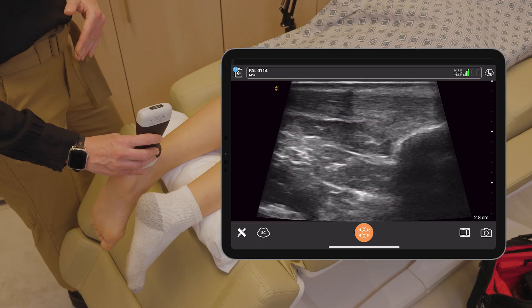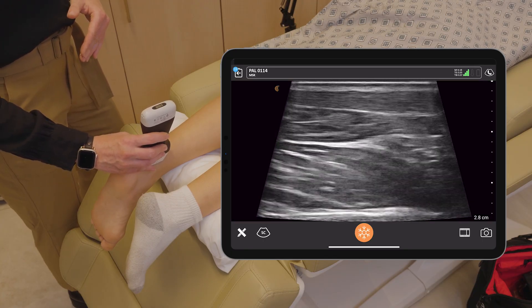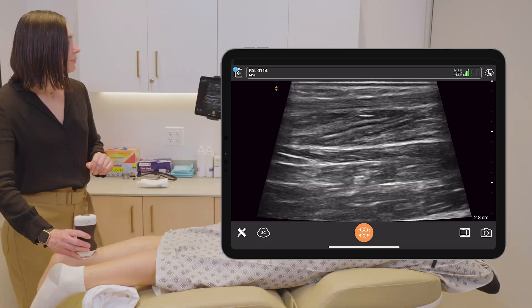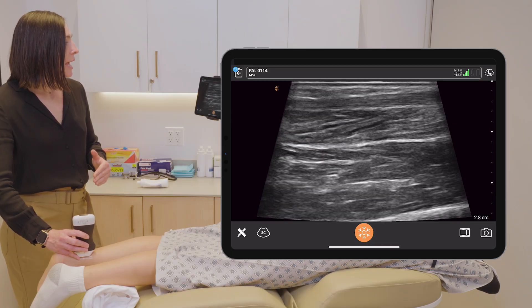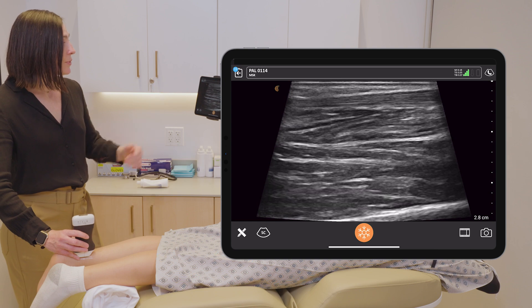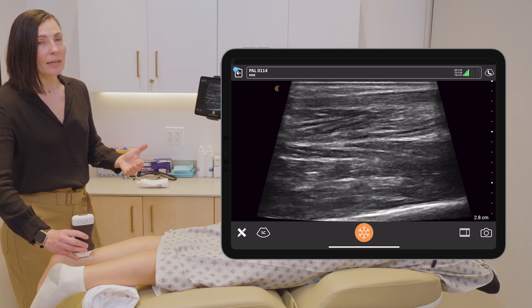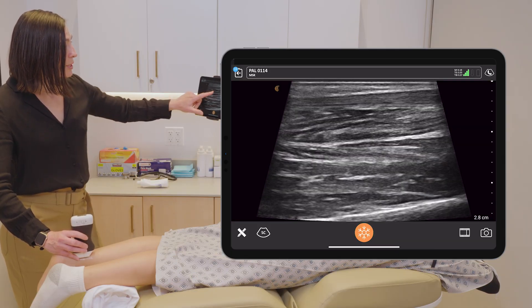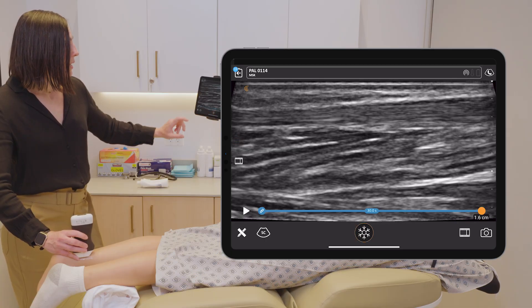Once I have identified my Achilles tendon, I will start sliding my probe proximally to visualize the length of the tendon, trying to keep it centered as much as possible. While scanning the Achilles, I'm looking for any kind of interruptions in the fibers, complete disruption, and also for fluid. You can also measure the actual thickness of the Achilles tendon — I'm going to decrease my depth to do so and freeze the image.